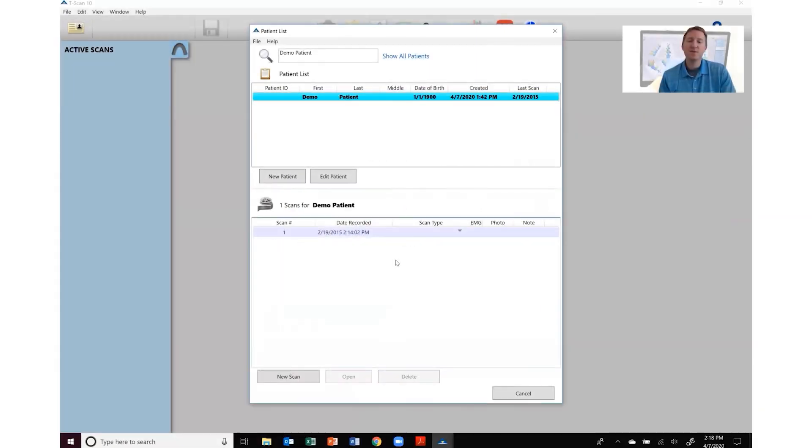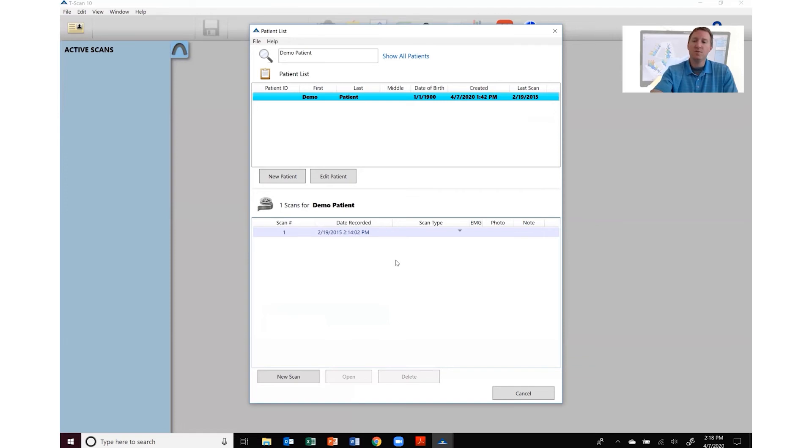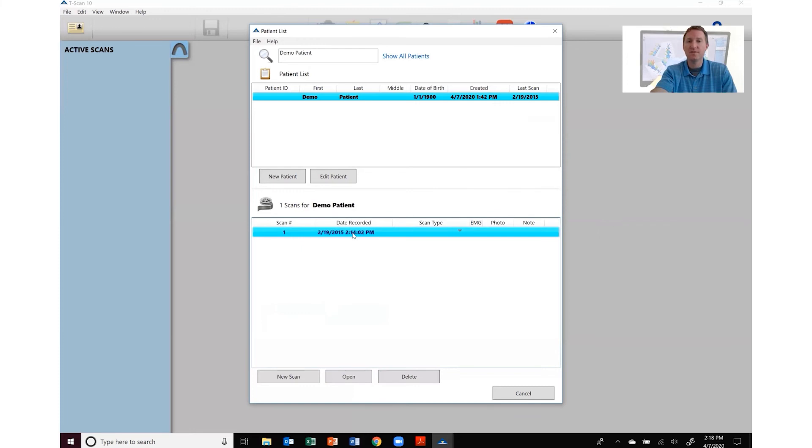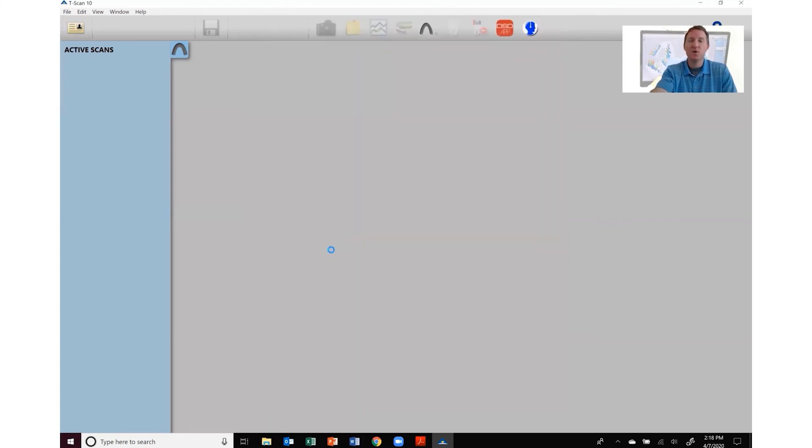So that's how simple it is to import your digital impression overlays. Once it finishes processing you can either record a new scan or go to an existing recording. Open it up.